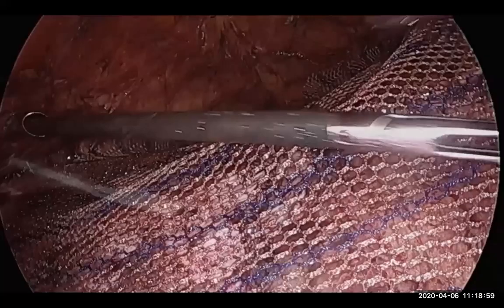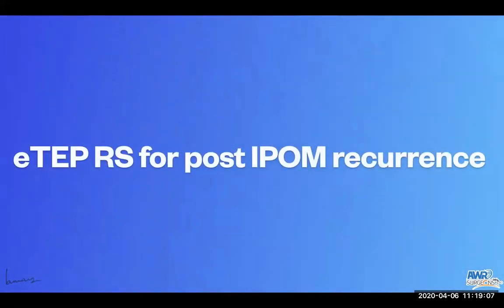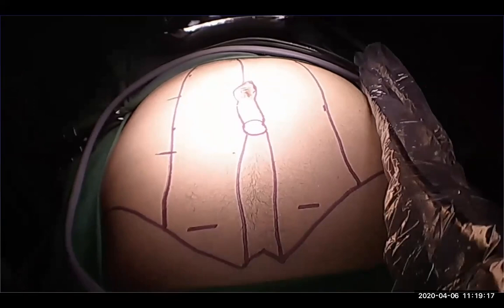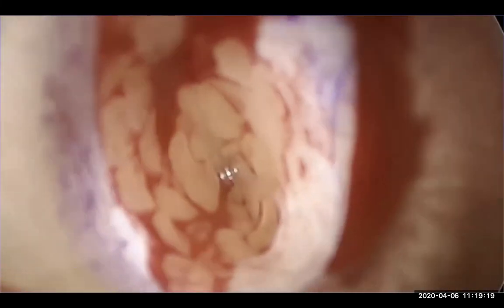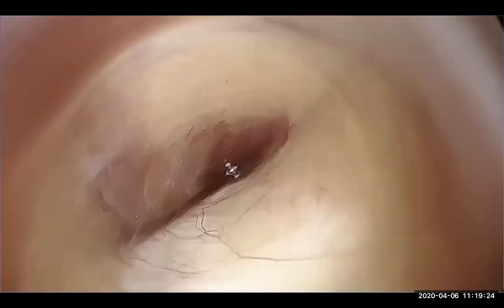Because once you take the pneumo out, if the mesh is well laid, then it just gets sandwiched in this plane. Okay, so for those of you who are saying, oh, this was a very simple case and there's hardly anything there, Deepak was asking me yesterday, what do you do in a post-IPOM recurrence? Do you have an issue or not? So this is optical entry. This is post-IPOM recurrence. So that's the posterior rectus sheath.